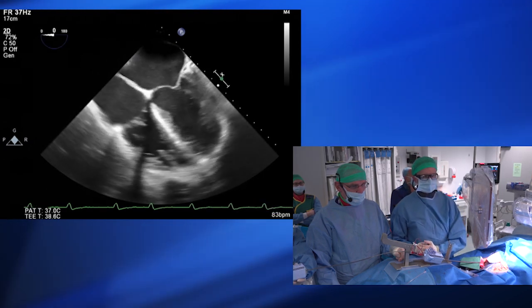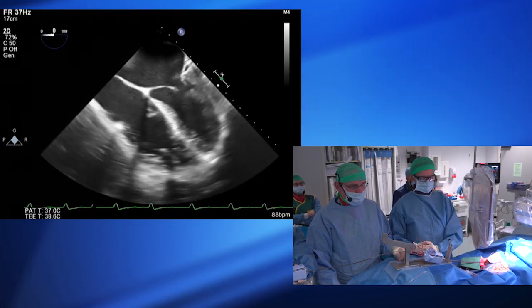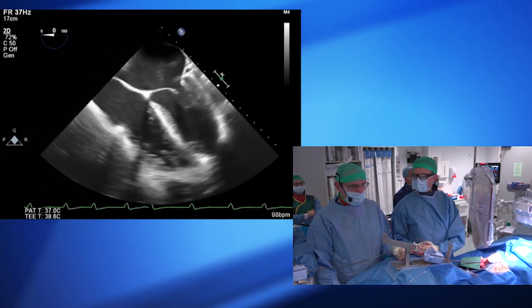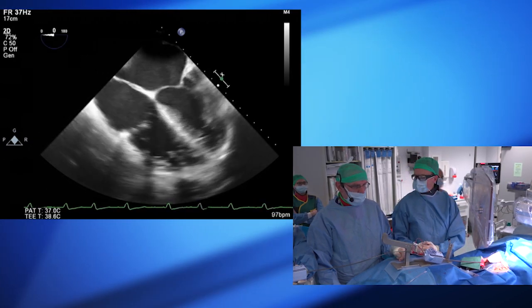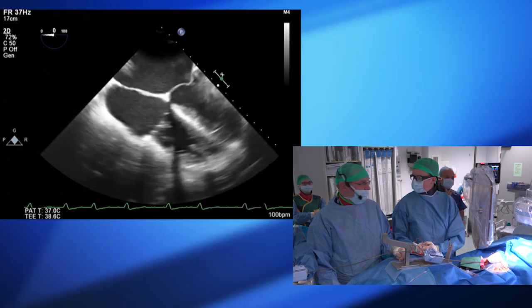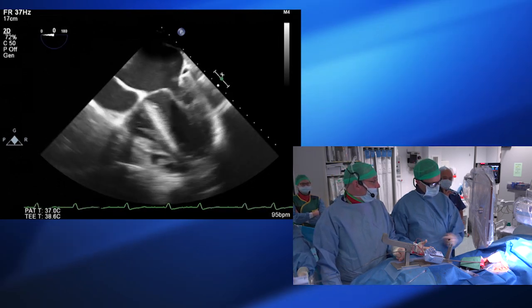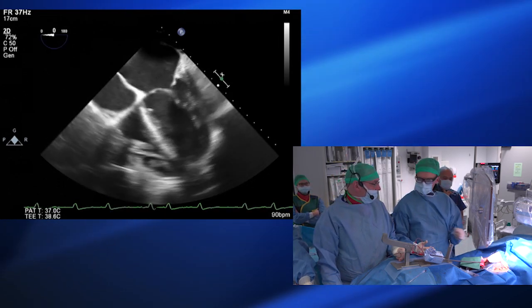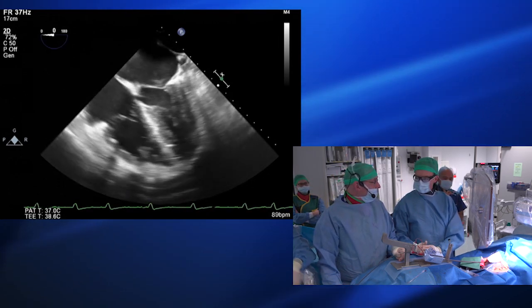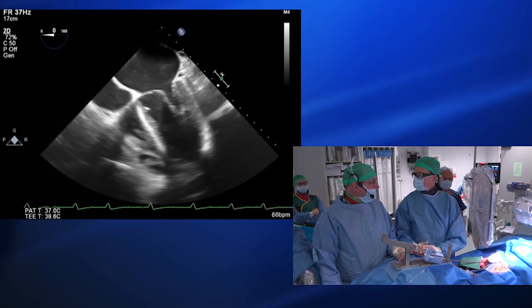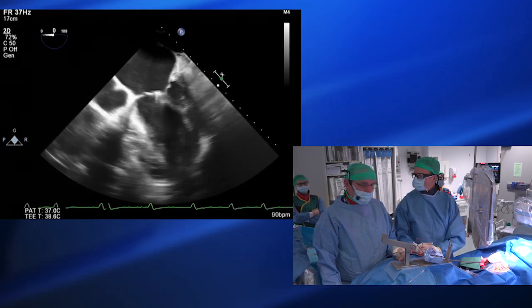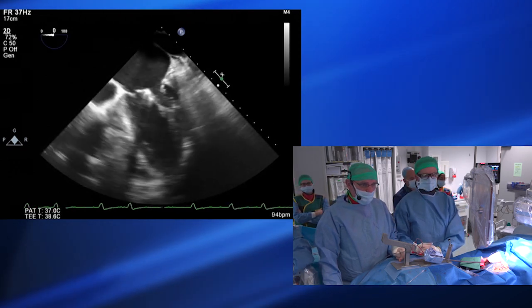Interestingly, we can also see his right ventricle is looking better than it was before. He'll go back to the ward — he doesn't need to go to the intensive care unit. We'll close the single Perclose here, and most of these patients go home the following day.